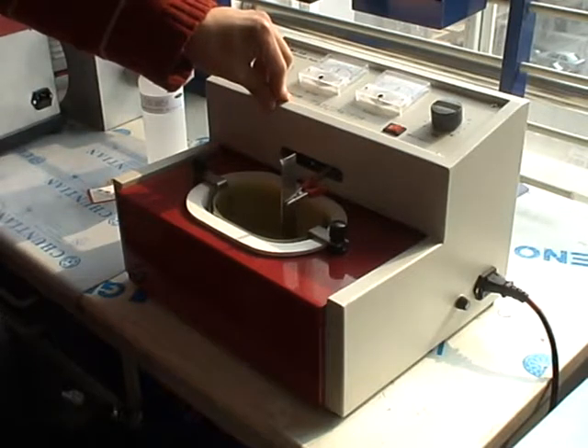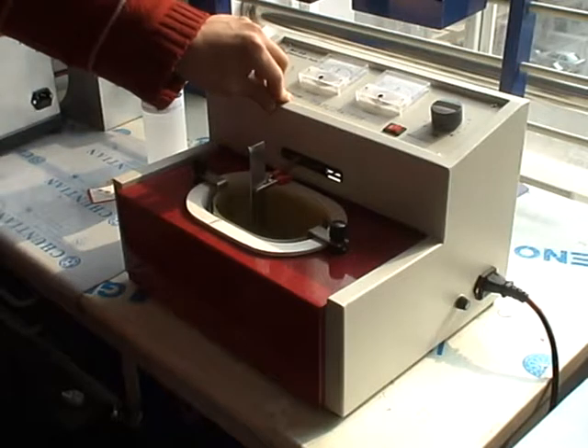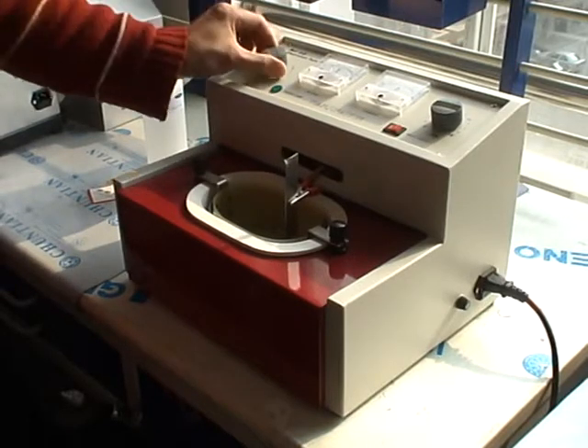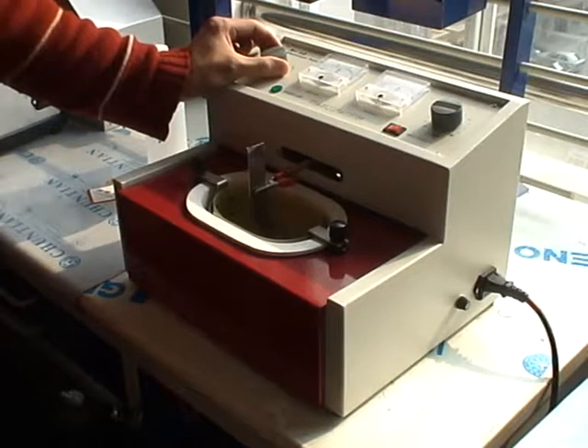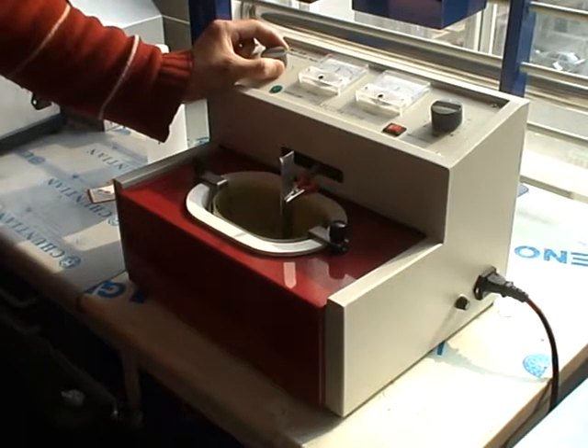This action is used to increase the temperature of the electrolyte. After that, adjust the voltage. Set the voltage to 15 volts.